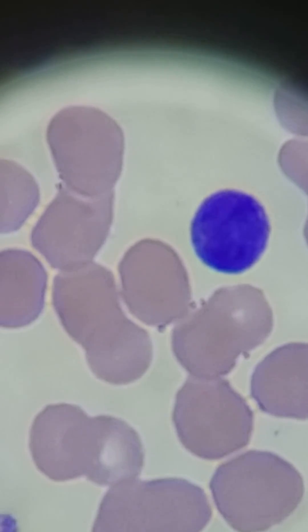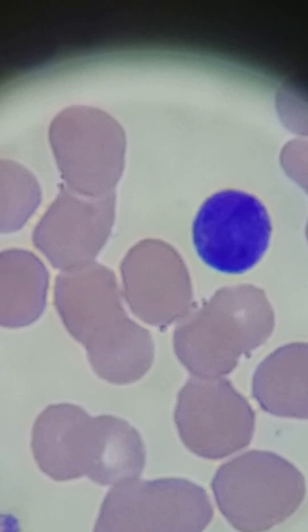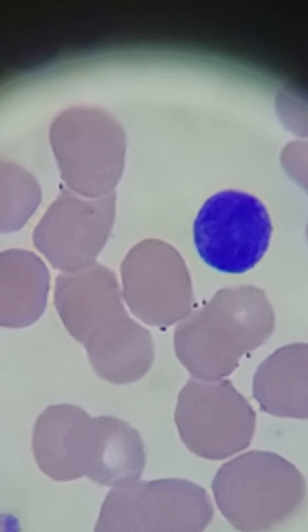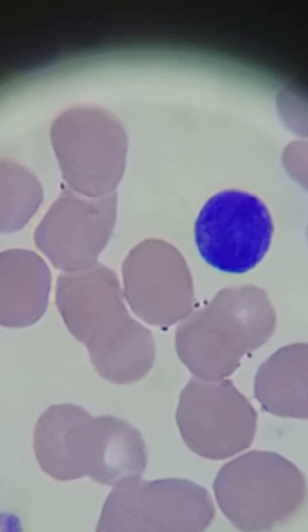Moving on, there's a small lymphocyte here right next to the red blood cells. Notice the size is very similar. You can hardly even see the cytoplasm — there's a little bit on the left, but it's really, really deep, dark purple. The chromatin is very condensed in the nucleus right there, so that's why you see such a deep, dark purple.